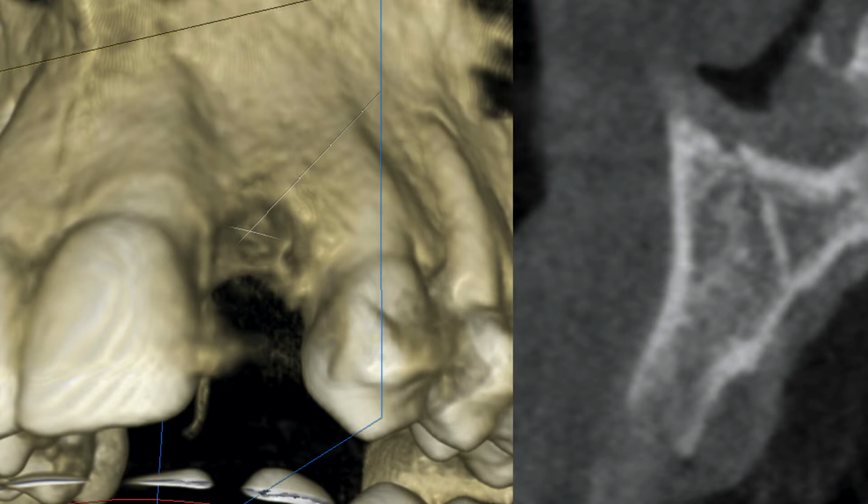This is, I think, probably the biggest thing that I can tell you I've learned in working out every one of the cases: before deciding or determining the treatment, we have to get more data, and there's no way you can get that without doing a three-dimensional simulation. So people talk the talk, but they don't always walk the walk. Meaning, it should be restoratively driven.